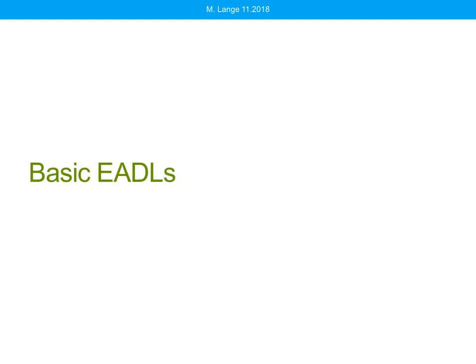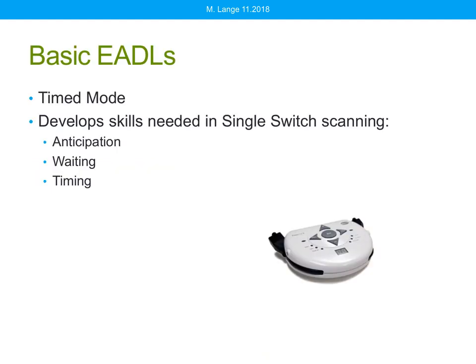There we go. So let's talk about some of the basic EADLs that we can use to develop these scanning strategies. We can use a switch latch and timer or a power link, and we'll talk about each of those here in just a moment.